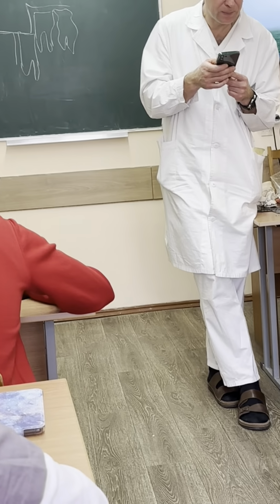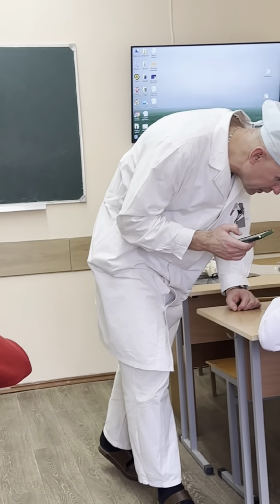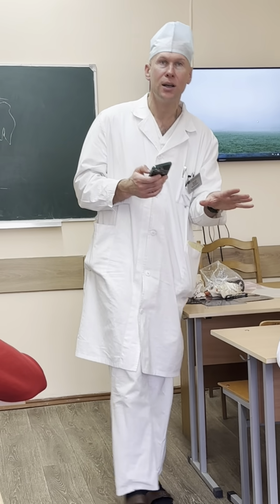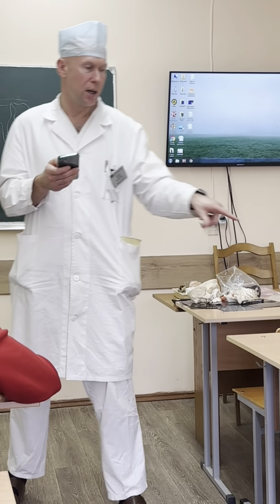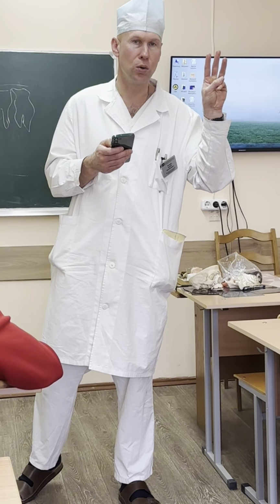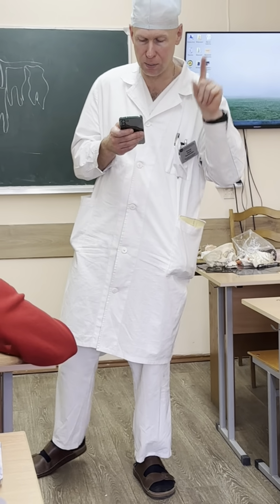Who finds the problems? The posterior wall of the maxillary sinus is broken. Yes, correct. Other students cannot understand and cannot see, of course. Sinus maxillaris, 3 walls fractures, yes, and arcus zygomaticus. All students see. Yes.